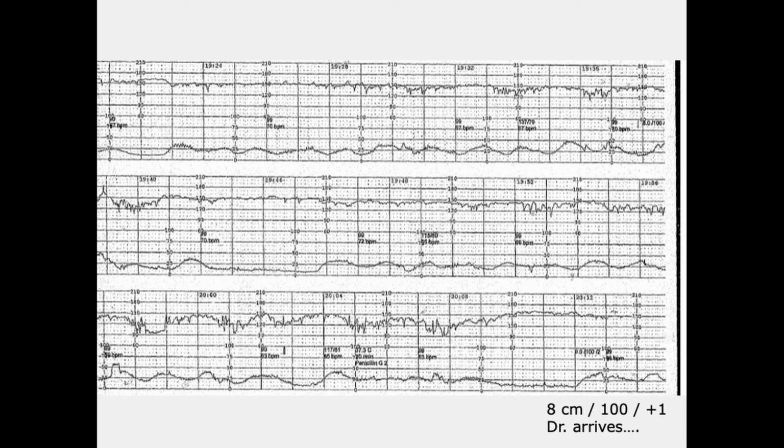And if we think this through, if you think about what's happening in the fetus, if we're having a fetal heart rate deceleration, we're not perfusing as well. We're not transporting oxygen around our body as well. So it's that time that the baby's stressed, and that's what causes the acidemia to develop. So if we are trying to recover, because we have built-in baroreceptors and chemoreceptors that respond to that lack of oxygen, trying to get our heart rate back up, our bodies are designed to survive. That's not okay. That's a stressful event. So the variability that's happening there, that's not good. That's in response to a fetal heart rate that's low.